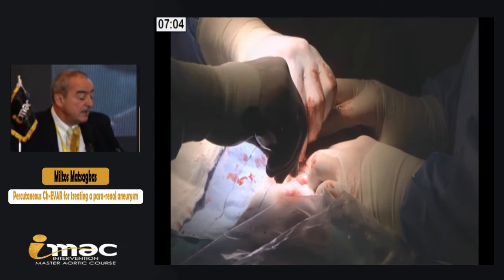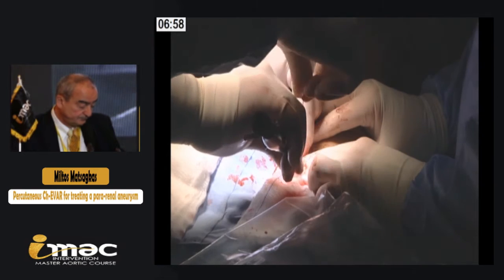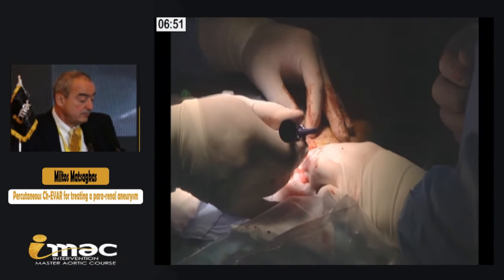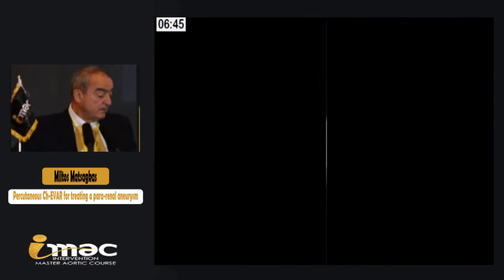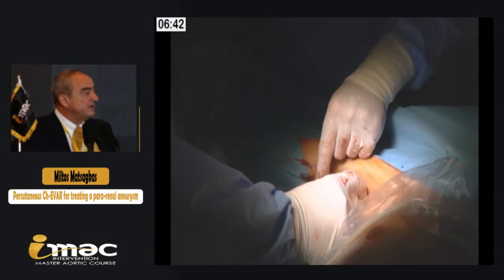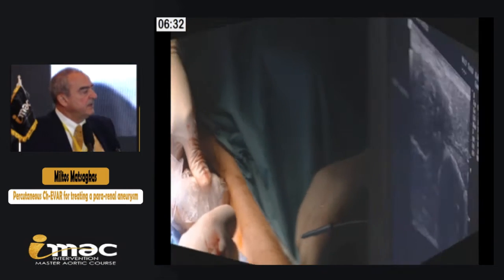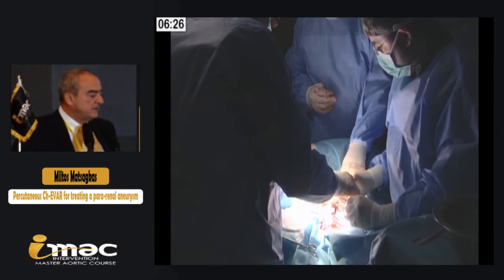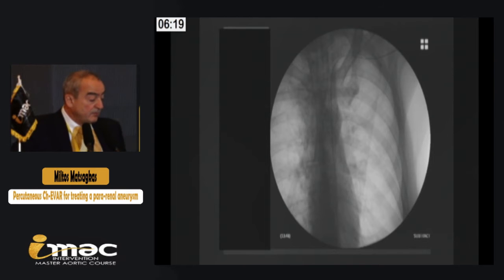On the main graft, as I said, two Proglides — you can see the second Proglide being inserted here. These are the sheaths in the femoral, and then we proceeded with catheterization under ultrasonography for the two brachial arteries, placing 5 French sheaths and using no Proglides but just manual compression after the procedure, as only 7 French ANL sheaths from Cook were used for catheterization and deployment of the renal stents.